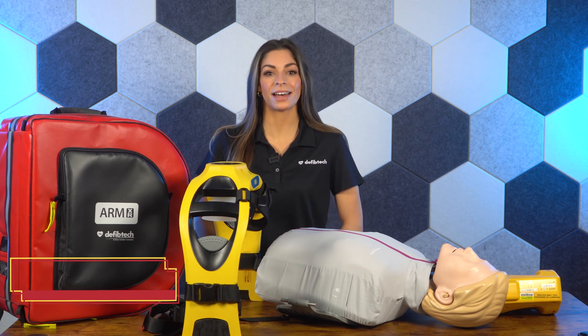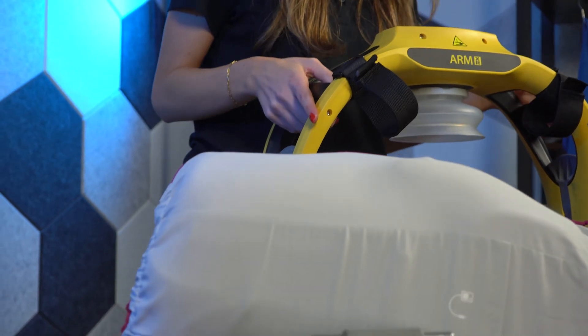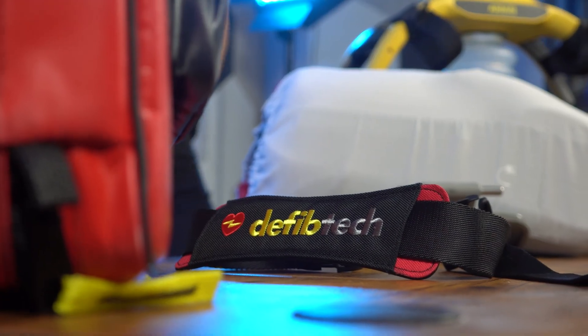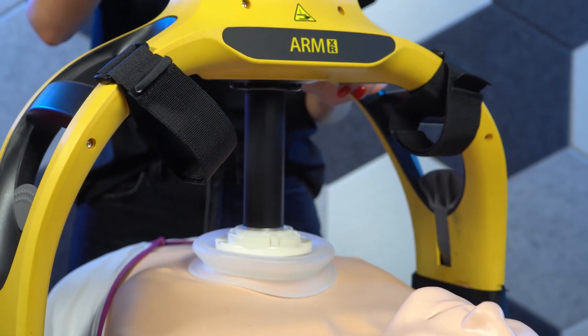Hi, I'm Katherine from DefibTech here with Master Medical Equipment to show you the ArmXR, DefibTech's next-generation chest compression device. The ArmXR is designed to help emergency personnel deliver continuous, high-quality CPR for patients in cardiac arrest.